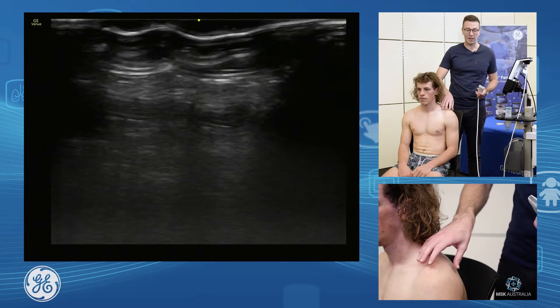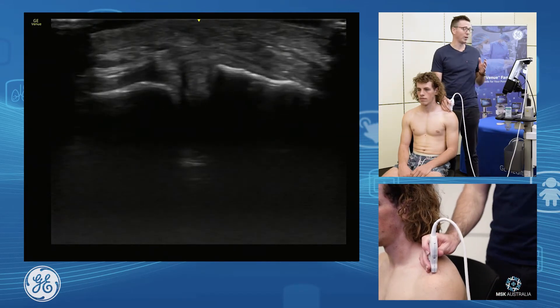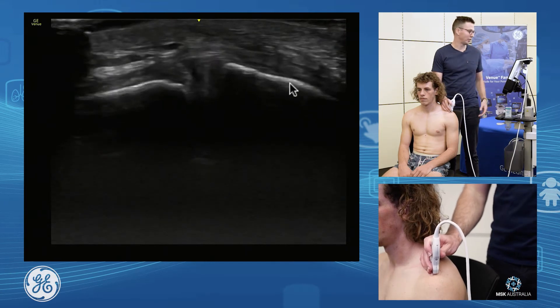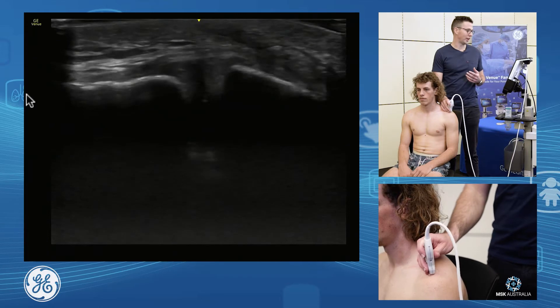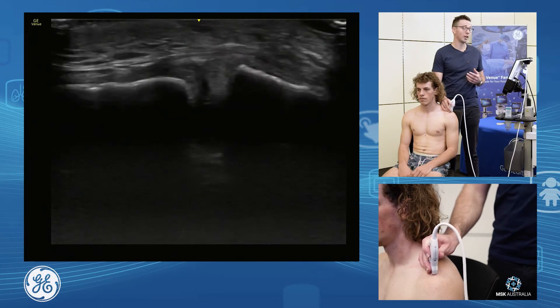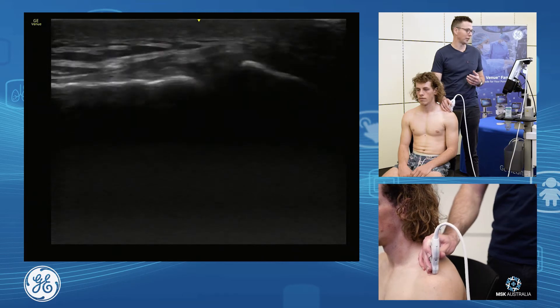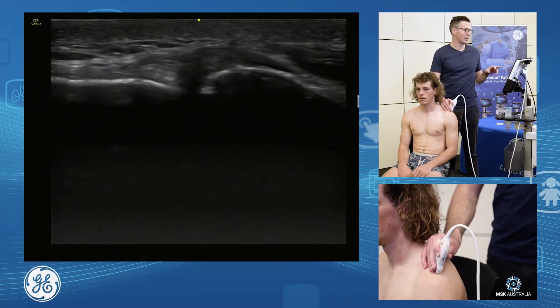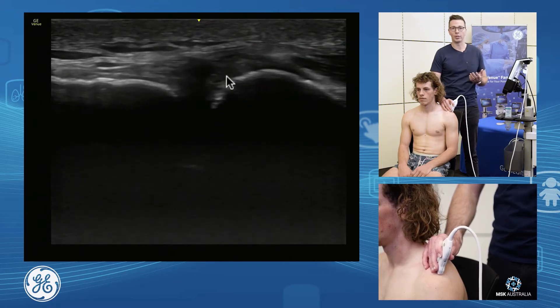The acromioclavicular joint — power Doppler, probe on. We line up and we see our clavicle and our distal acromion. We assess the joint capsule, we scan anteriorly, we scan posteriorly, so we go the whole way through that joint from the front to the back. We assess what's happening at the bony morphology of the distal end of the clavicle, assessing for osteolysis.